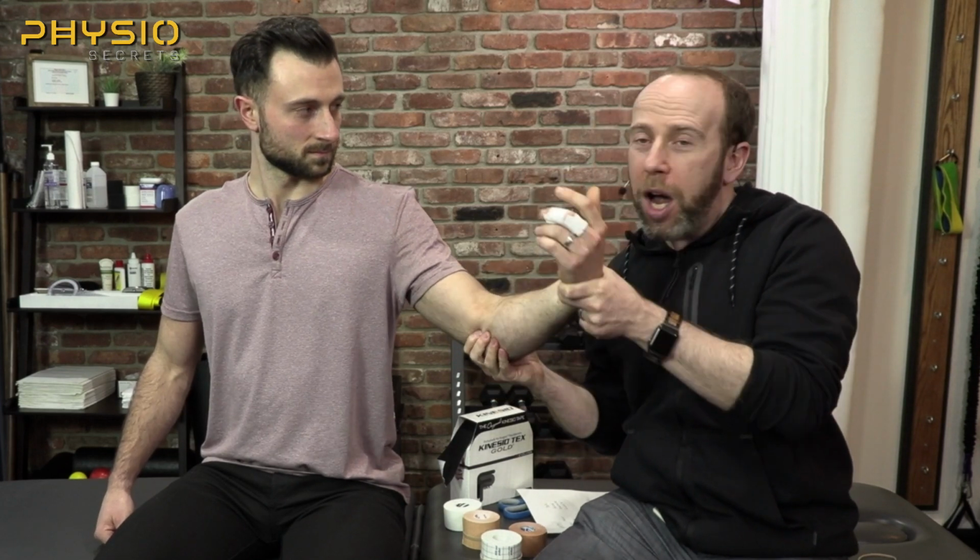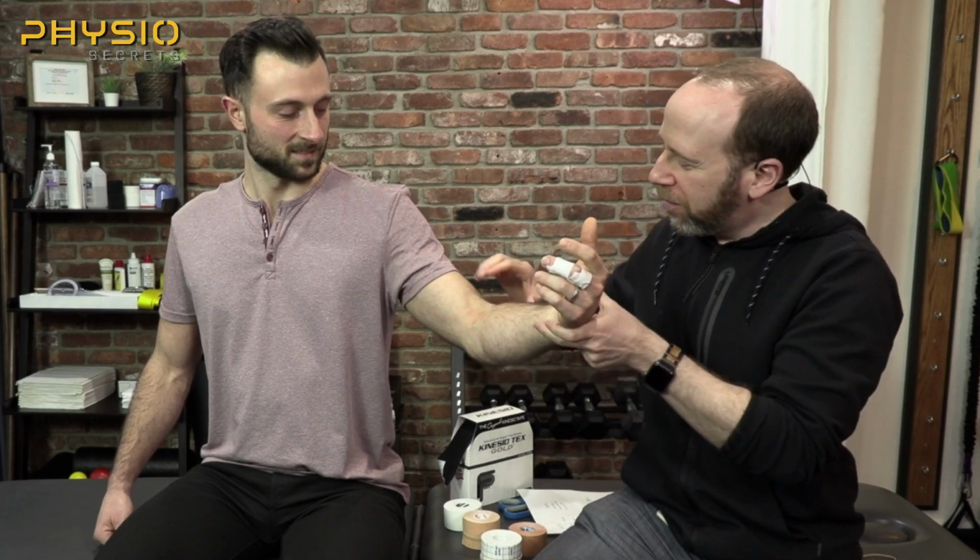So if I apply a rigid tape, like Leuko tape, and I put his arm in this position, I will literally block his ability to straighten his arm, which probably isn't a good idea because he's probably going to get an elbow flexion contracture. But if that was my goal, right? If I use K-tape and I put his arm in this position, he will still be able to extend his arm because the tape is flexible.